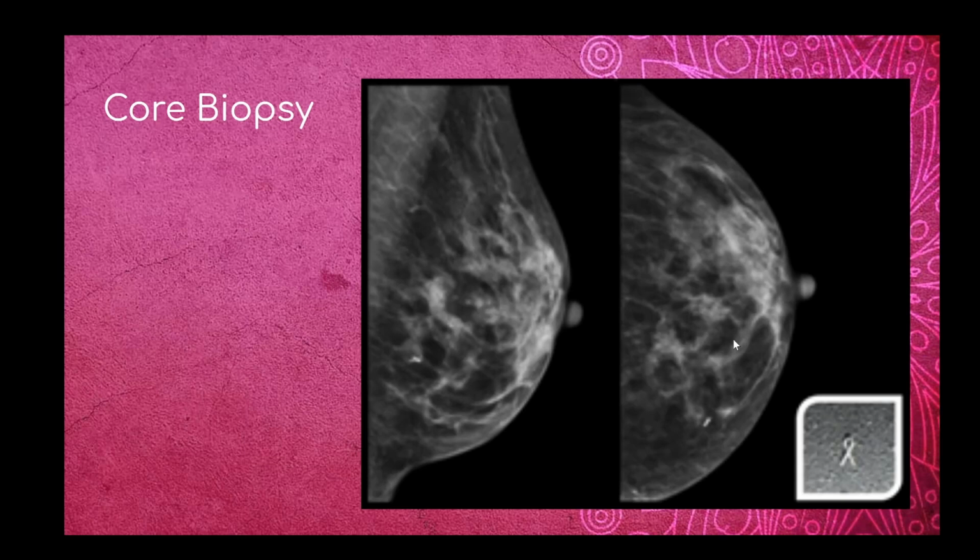What is preferred is to do a core biopsy. Now, a core biopsy is a procedure in which a large needle, a large bore needle, is inserted into the breast. And when you insert into the breast, it has kind of this hollow core to it. And when the biopsy gun is fired, it kind of splits off this like little sharp tubular knife, and it grabs a hunk of the lesion and pulls it back into the chamber. And now we've got like these little wormy looking tissue samples that get sent off.